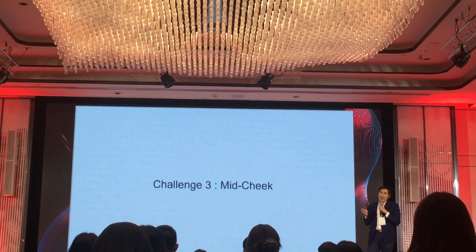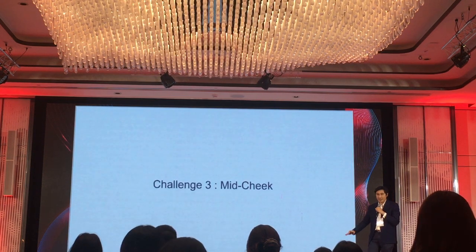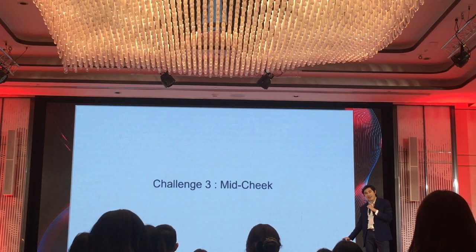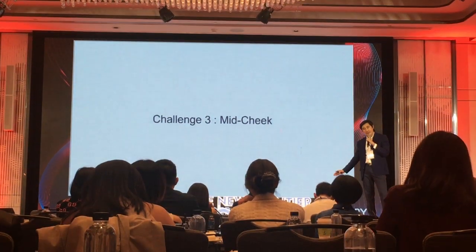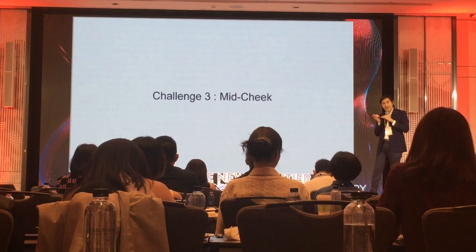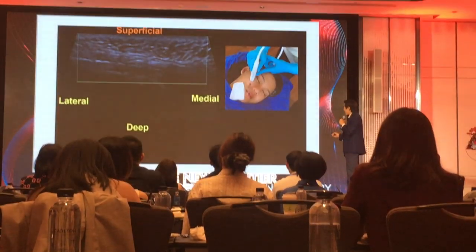So my solution is to move downward, deeper into the sub-SMAS plane, and lift from the sub-SMAS plane, like when you inject filler in the deep medial cheek fat. In this case, I use the deep medial cheek fat and the zygomaticocutaneous ligament as the hanging point to lift up. And the result will be a more natural lift, like when you inject filler in the deep plane. See how it's done.